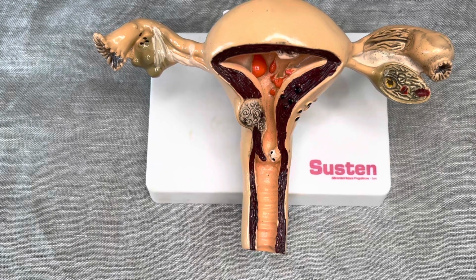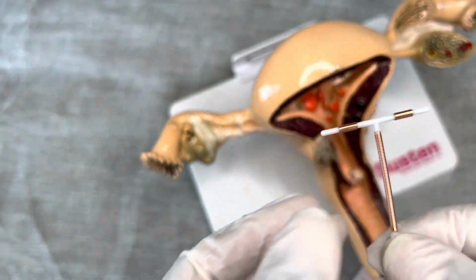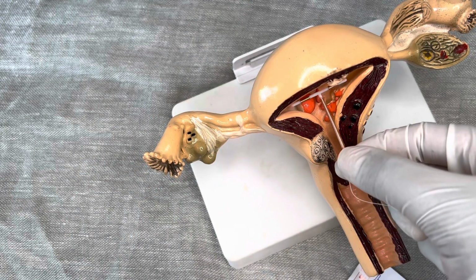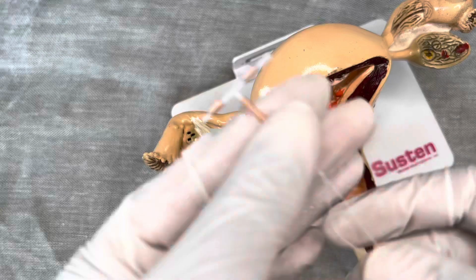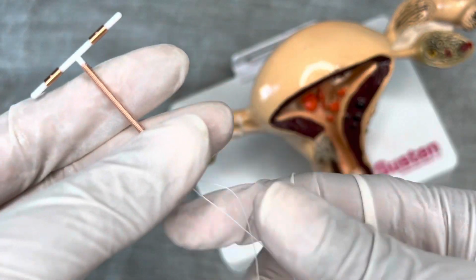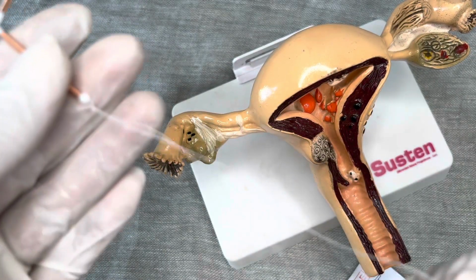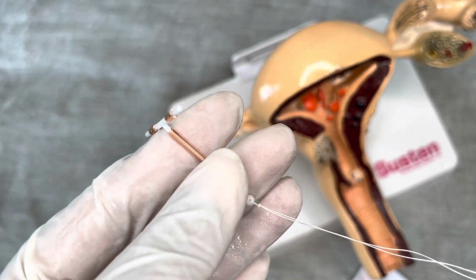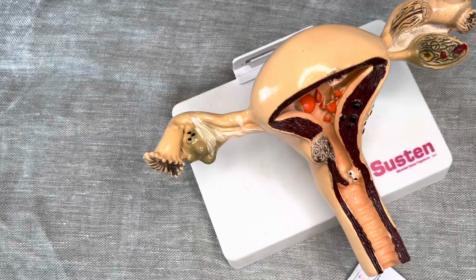Now, after you've done the sound and you've told the patient to relax, this thing looks like this. This is what will be in your uterus to avoid conceiving. So this is the copper T wire and the strings that we put outside so that we can help to remove it after you maybe want to start conceiving. Okay, so now I want to tell you the importance of the measurements.